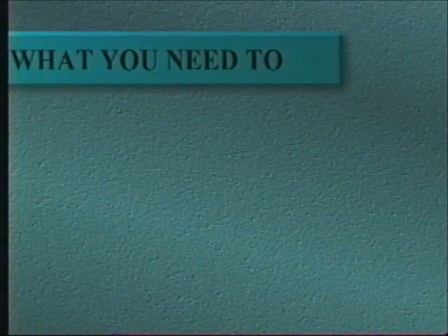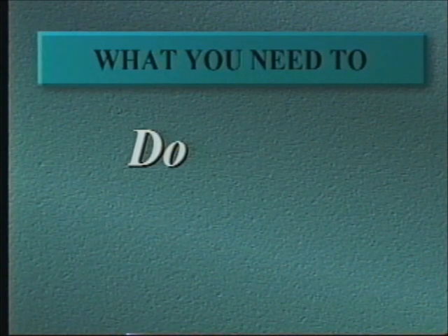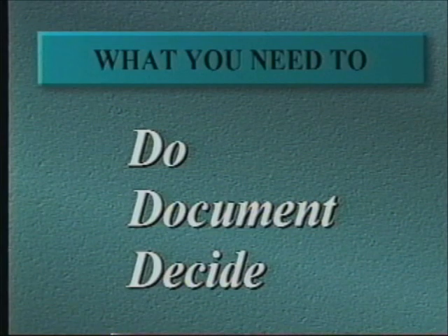are serious biohazards. Before implementing automated cell counting in your facility, there are certain things needed to be considered. The 3 Ds: what to do, document, and decide. Before you can even consider automating your body fluids, you need an instrument that provides some kind of picture, a histogram or scattergram, to help you interpret results, and an instrument that can maintain a low background, preferably 0.